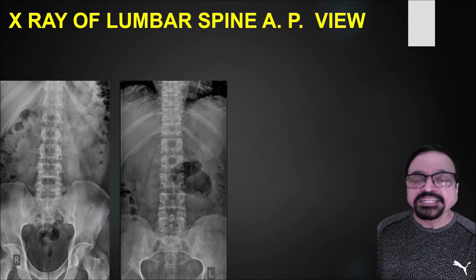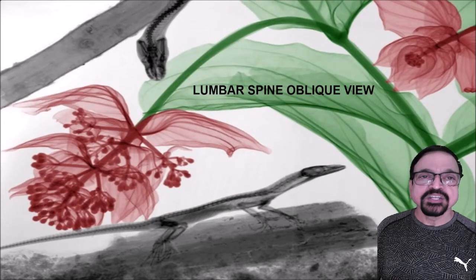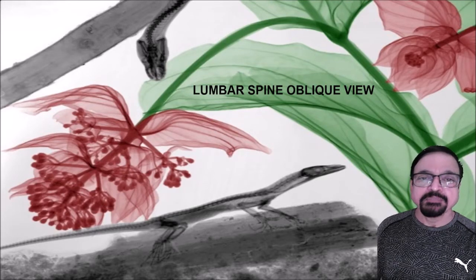Number two, the patient's back has to rest totally over the couch so that there will not be any distortion of the vertebral body. You are seeing all the vertebrae, they are well placed, well outlines are seen, and the radiologist has got no complaint whatsoever. He has got no problem because all the pedicle, spinous process, transverse process are well seen. That is the main aim of the radiographer. He has to check it and then send it for reporting.